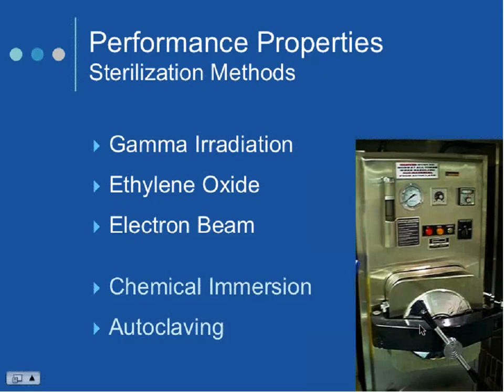Ethylene oxide is taking that toxic gas and putting your device into a chamber. You pre-moisturize the part so that the gas will actually penetrate better. Expose it to the gas, then it's removed and de-aerated for up to 24 hours. So I don't know of anybody that's doing that on site. Most adhesives withstand ethylene oxide. We run our adhesives through a couple to 3 cycles of it.